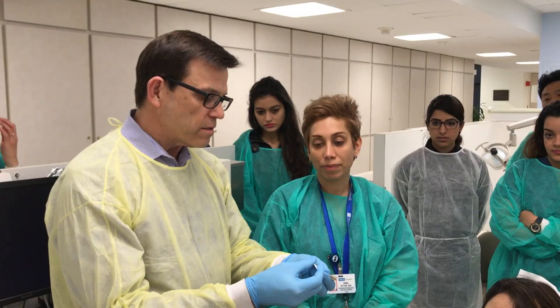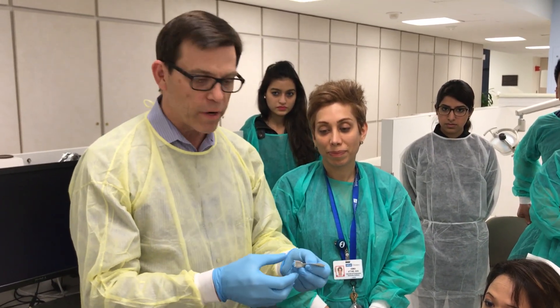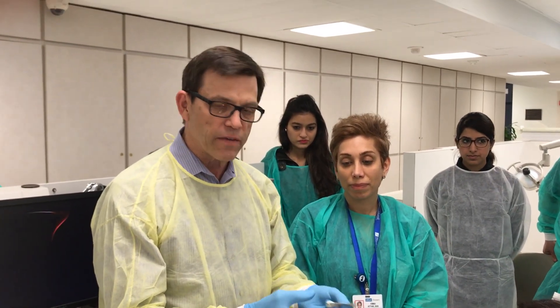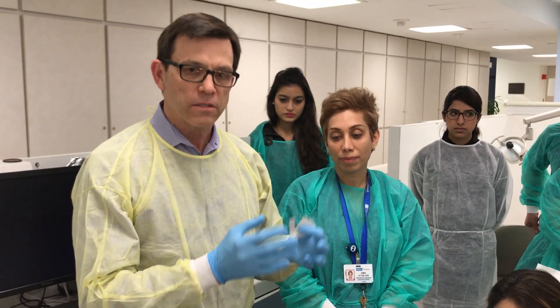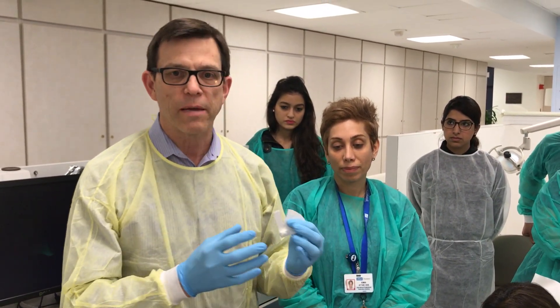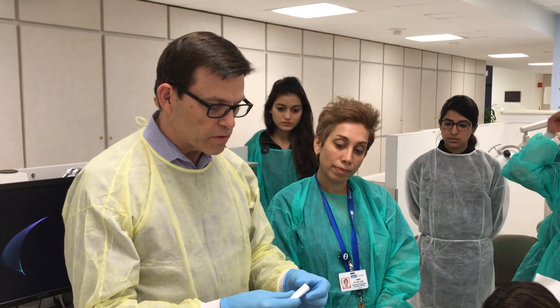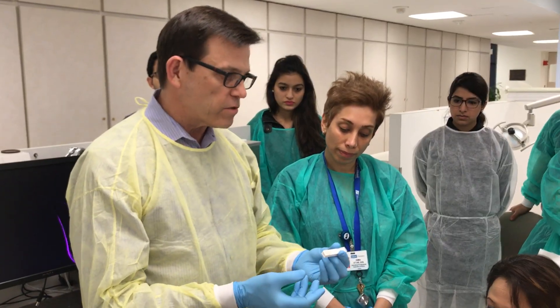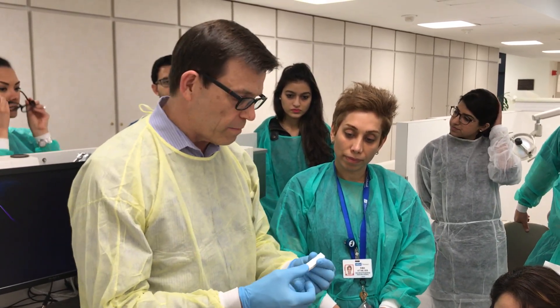So about five of these equals a millimeter. That distance is not that critical. It is important maybe from a relative standpoint — how many leaves does it take to capture a centric relation record on a given patient typically relates to how much slide there is from their centric relation position to their MIP position. One of the things we're going to want to do is make sure that we get the rhythm of this down with the patient.